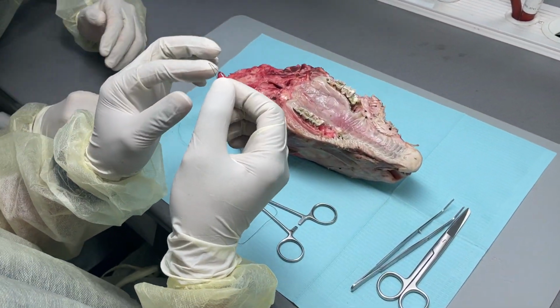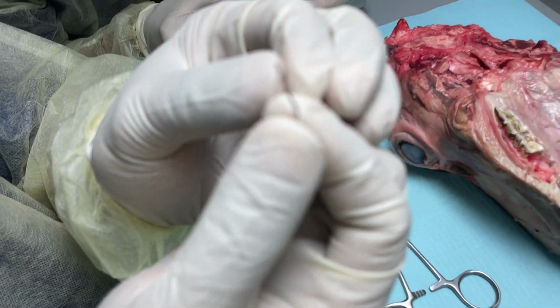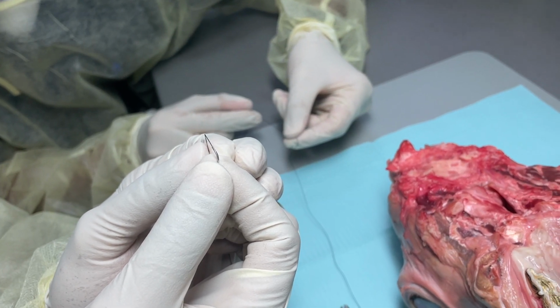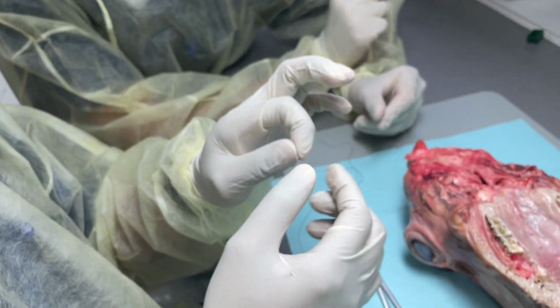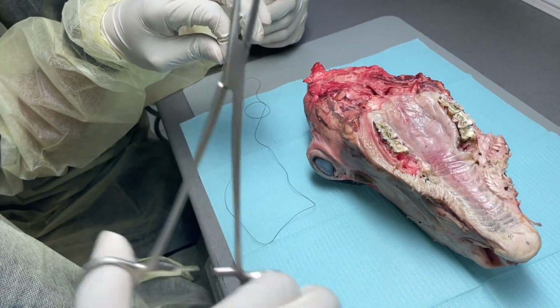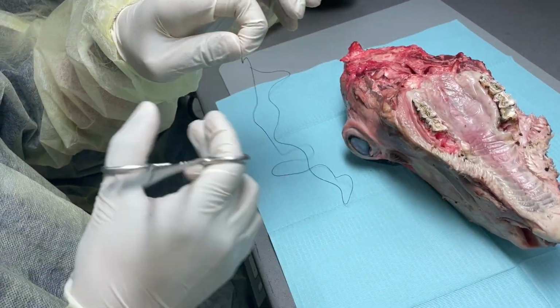Now you see here, can you tell me, is it swaged or is it eyed? Swaged. Look here, swaged. There is no eye. So this is less traumatic to the tissues. Now, tell me, where will I hold it?